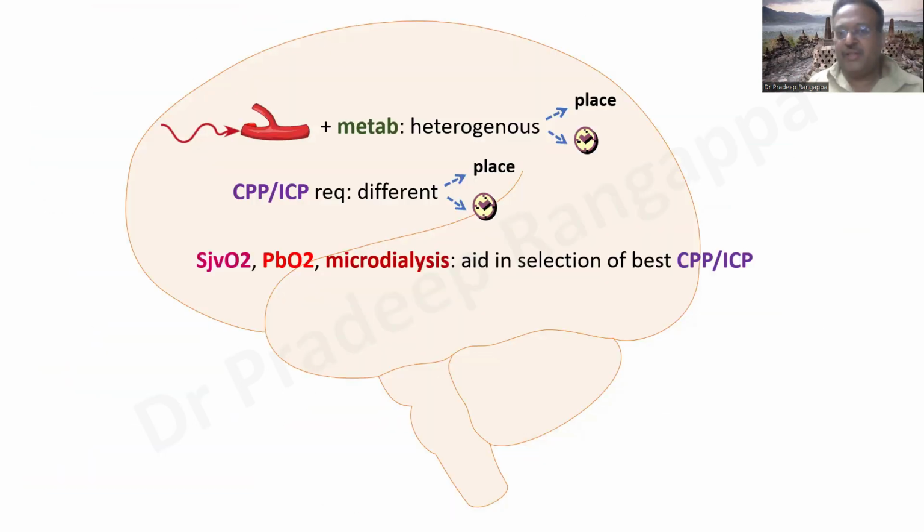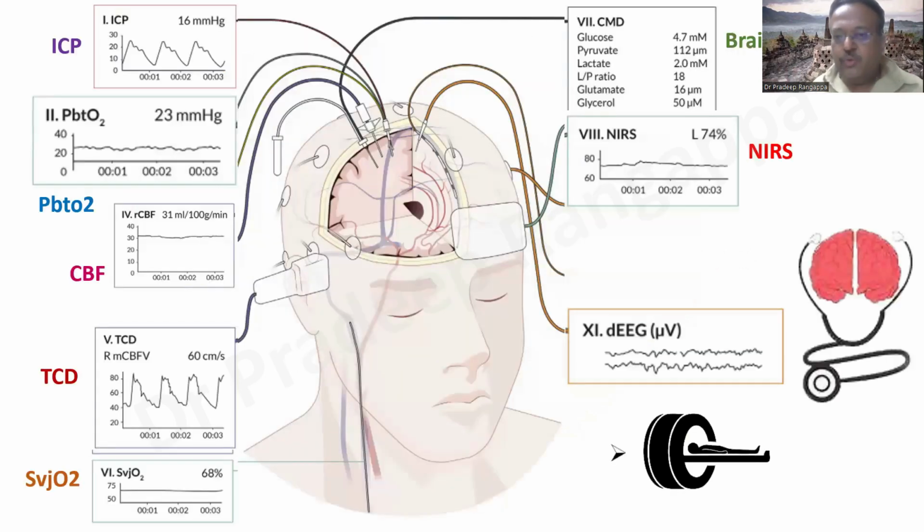So my summary is still this figure. This pretty much summarizes multimodal monitoring. Basically, whatever tools you have, clinical remains the gold standard, imaging remains most important, and you use other adjuncts. If you have ICP, use ICP. I have used jugular venous saturation in Australia, where I'm aware of the nitty-gritties, because the probe keeps getting displaced. But near infrared spectroscopy is available in India, so we use it for a couple of patients in an experimental mode. And continuous EEG is possibly the way forward. There's a separate video you can see; I didn't cover it in the paucity of time.